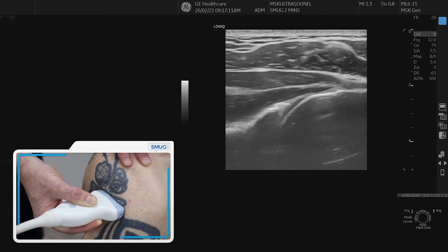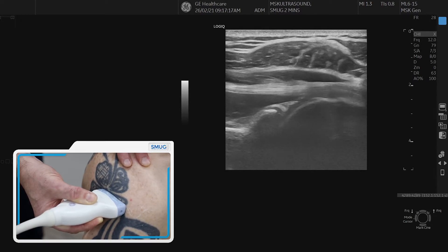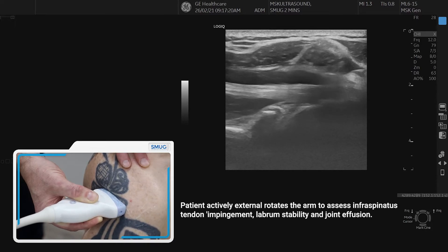Once you have those landmarks and you put the joint in the middle, then you look for the infraspinatus, which is quite a nice thick intramuscular tendon. If you externally rotate again, you can see the tendon moving towards the joint, and back.